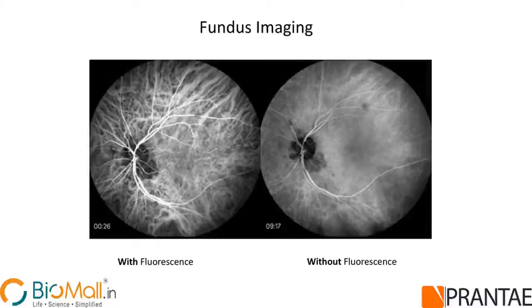In the first image, you see that the veins or arteries that carry the dye fluoresce very brightly, so you see a huge amount of contrast in the image. Whereas after some time, when all the ICG is metabolized and reduced in circulation, you see those details are completely lost. So fluorescence has been very widely used as an enhancer for imaging.